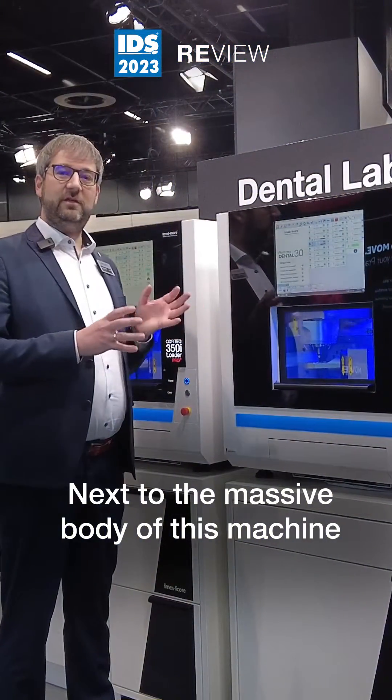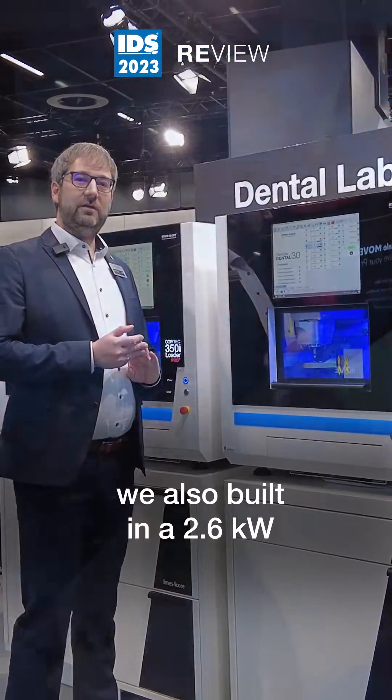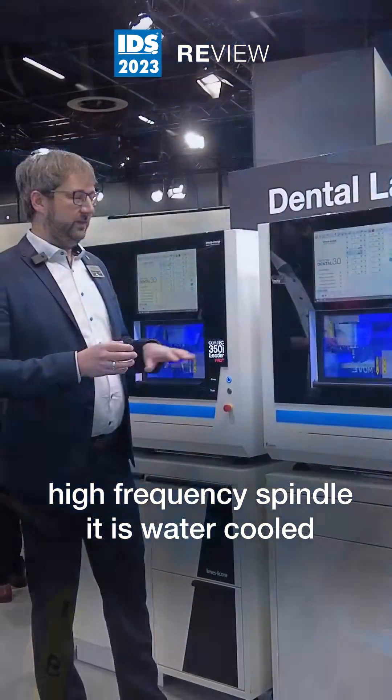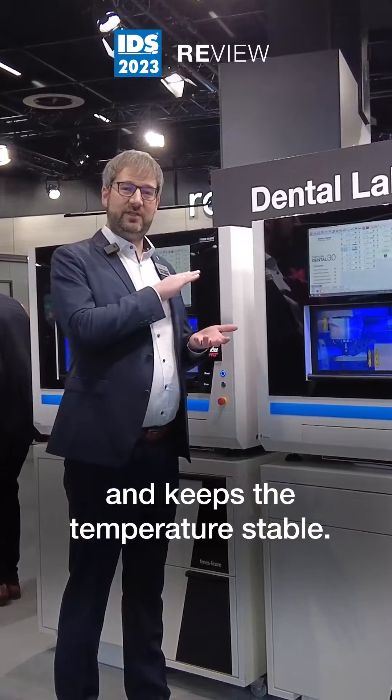Next to the massive body of this machine, we also built in a 2.6kW high frequency spindle that is water-cooled and keeps the temperature stable.